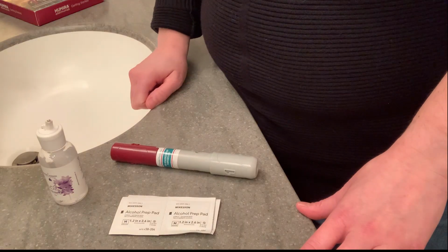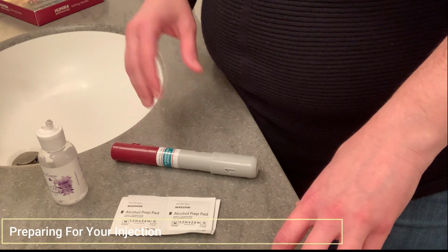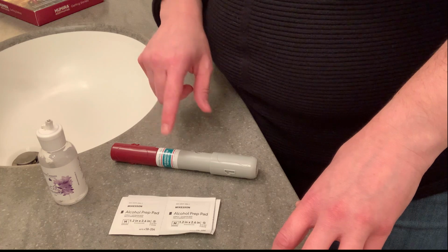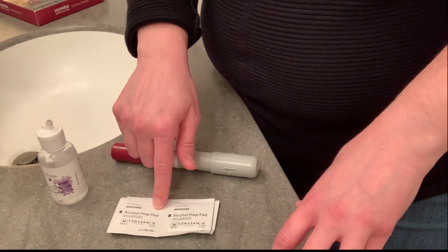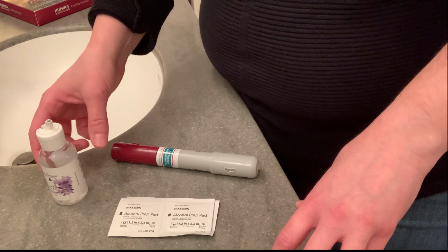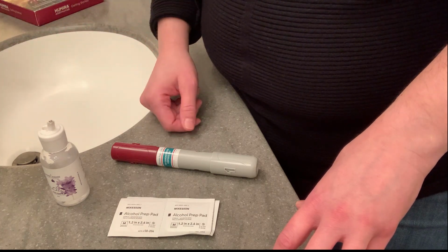So grab your pen and let's get to it. So before you start anything, what you want to do is make sure that you have all your gear set up before you start injecting. So you'll want to have the Humira, alcohol prep pads, as well as something to wash your hands. So this can be hand sanitizer or good old soap and water.